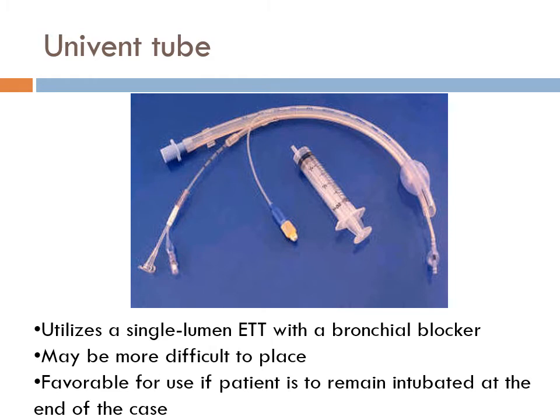Okay, pass this around. Remember, this is my look-see bronchoscope port right here. When you don't have a scope in, and even when you have a scope in, just like bronchoscopy, you're leaking. It fits around the rubber thing, but you're going to leak through this gasket. You've got to close it when you're not using it. Otherwise, if you forget to, you're not ventilating. You're not getting your tidal volume, so everything's lowering. So, problem solved, right?